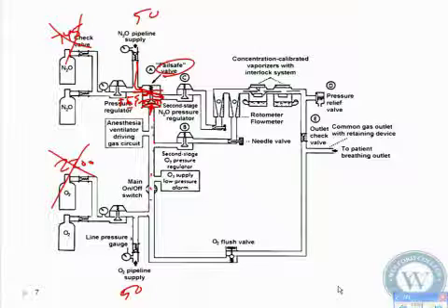There's no mixture of gases. So then the nitrous is going to flow through. If your PSI is less than 20, then this can't happen. So that diaphragm then stays on the bottom of the fail-safe valve, and you can't have any nitrous that flows at all from your cylinder, from your pipeline. It doesn't matter. Okay? So is that a little more clear?